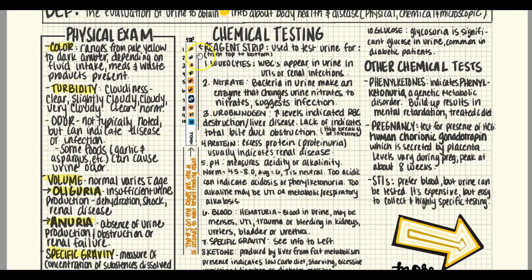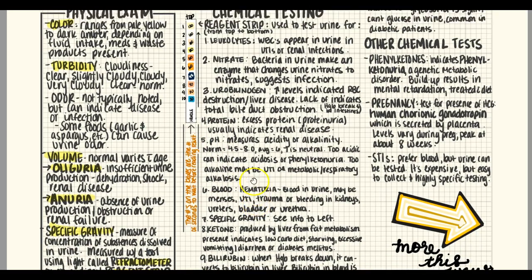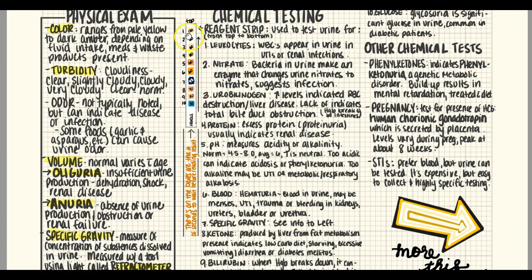But the boxes do match up on the strip to what you will see in class on the McKesson strips themselves, and the times that are on the strips are the same. So starting at the top, box number 1, you would read at 120 seconds elapsed after dipping.